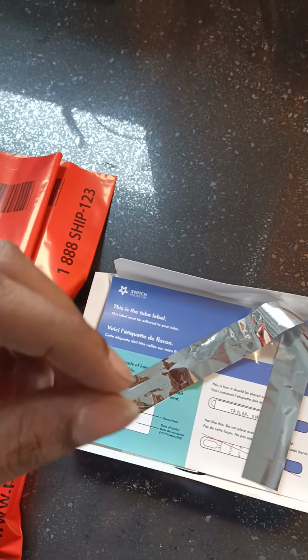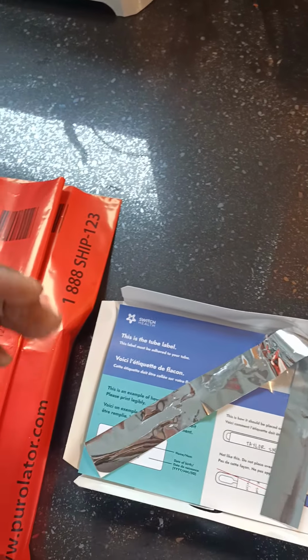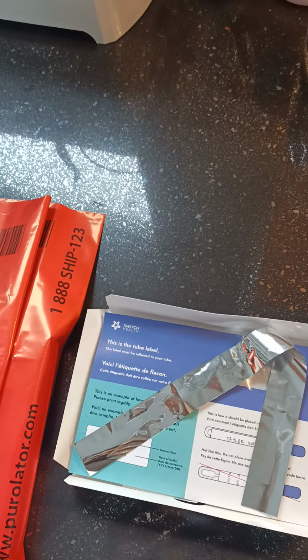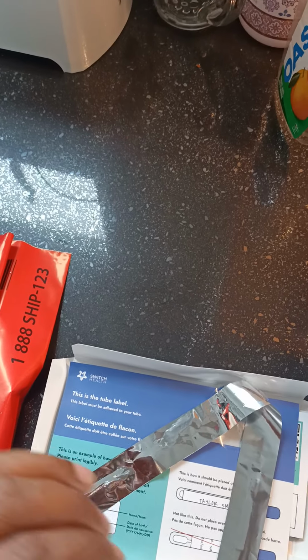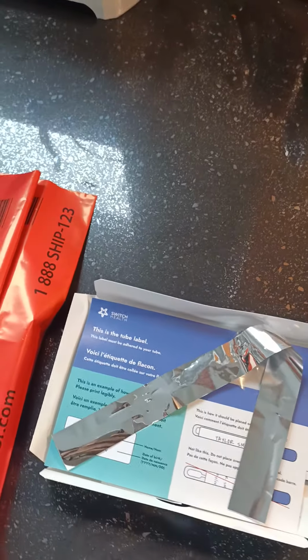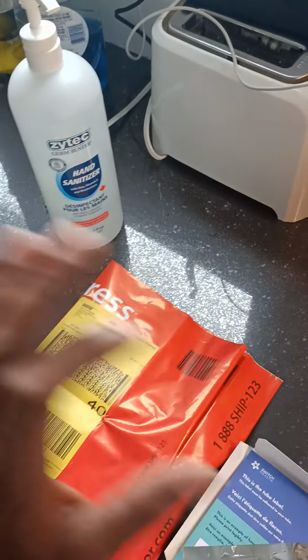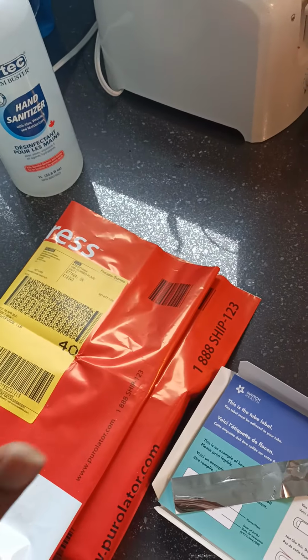And on day 8, you can just press start with the test. Once you log in, there are 4 options at the bottom of the screen. I will show you that. From the bottom screen options, you can choose the option for your home test. Once you choose that, they will try to connect you to a nurse, and it will take from 10 minutes to 2 hours as per what they have displayed there. For me it took around 15 to 20 minutes.